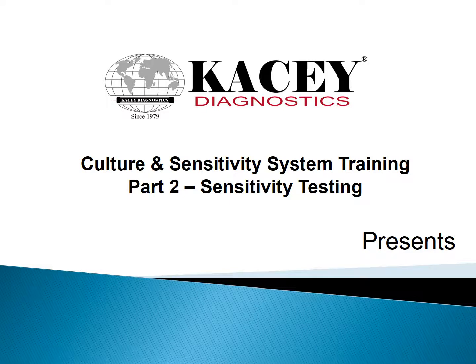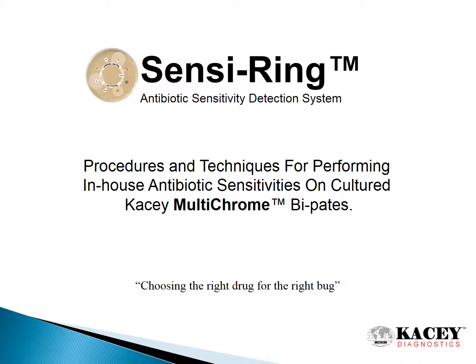Welcome to Kacey Diagnostics presents Culture and Sensitivity System Training, Part 2, Sensitivity Testing. Procedures and techniques for performing in-house antibiotic sensitivities on cultured Kacey MultiChrome biplates. Choosing the right drug for the right bug.